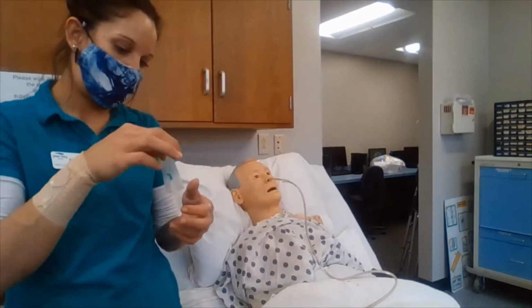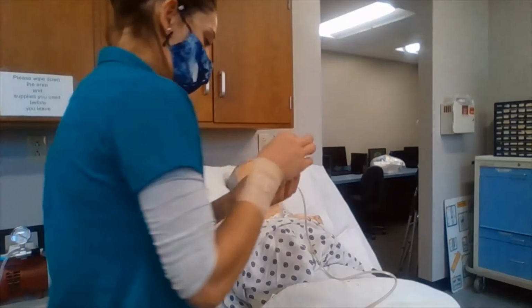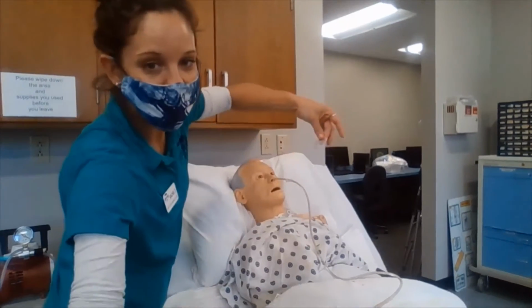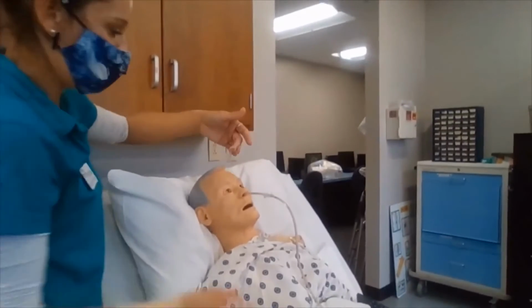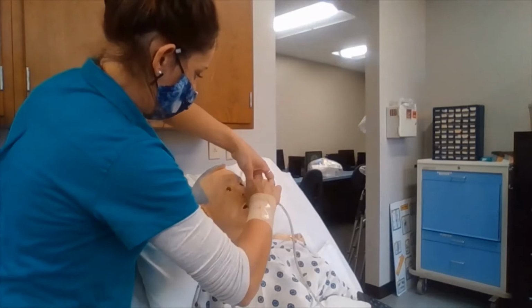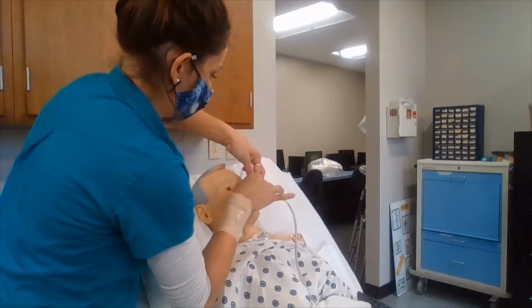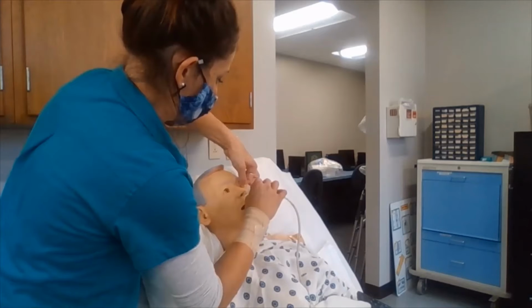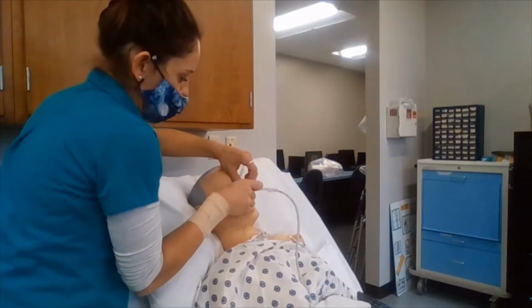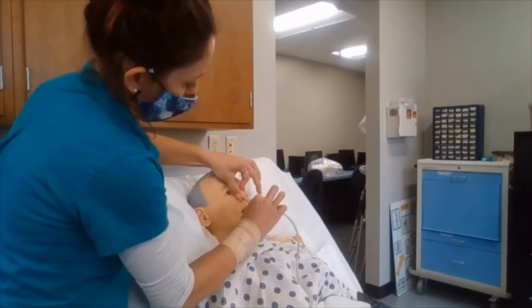So I'm using my 4-inch tape with the long split down the middle. I'm going to be placing the tape around the tubing here, and then I am going to take one of the sides of my tape and apply it on one side of the nostril, and then I'm going to take my other one and apply it to the other side, and we are going to ensure that it is in place.